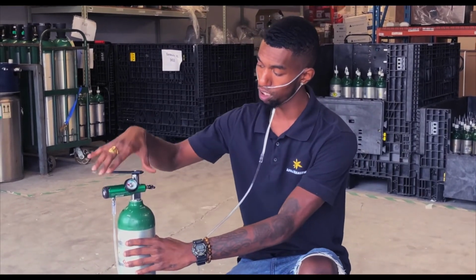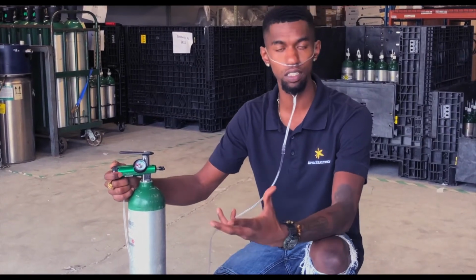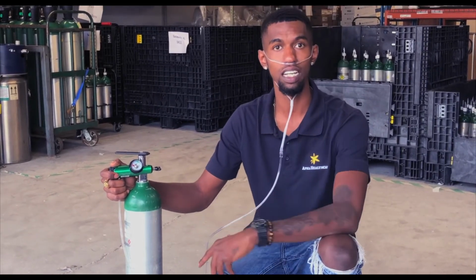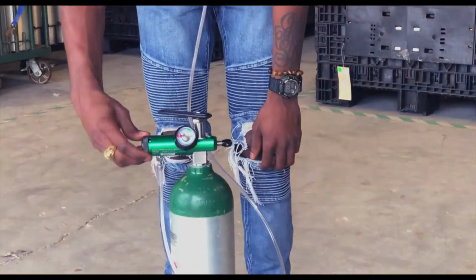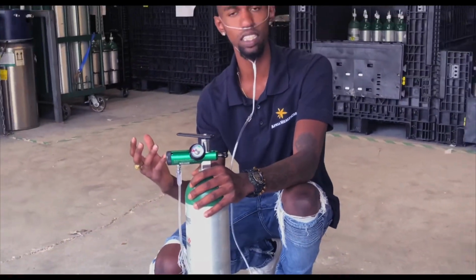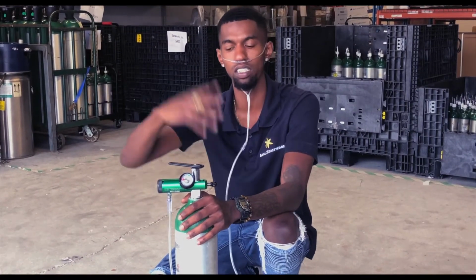Once you have your cannula in, you have your regulator hooked up to your E-tank or whatever tank you're using, you have your key ready to give you oxygen, then you want to find your liter flow. Now, your liter flow is something I'm not going to tell you. That is something that you and your doctor have talked about. So, if I'm looking at my tank, I notice to the right of the tank, I have a black dial. And this dial goes from 0 all the way to 8. Now, your regulator may be different. It could be a children's regulator. It could be an adult regulator. This one happens to be an adult regulator, so it goes to 8. We have regulators that go from 0 to 15 and so on and so on.